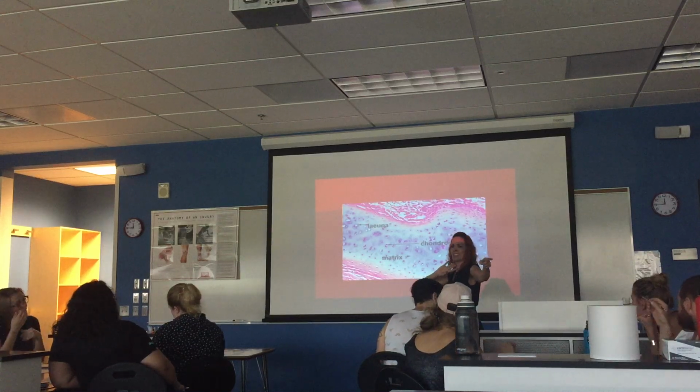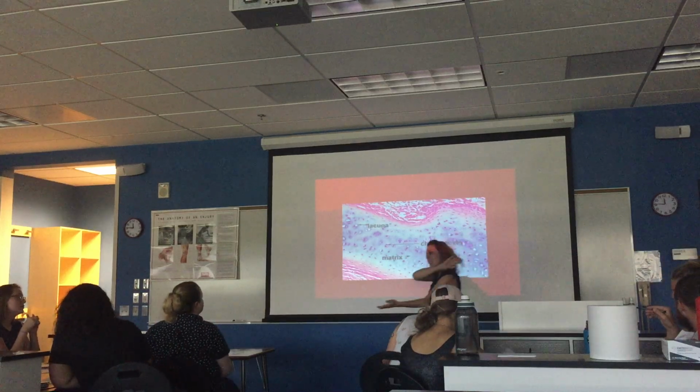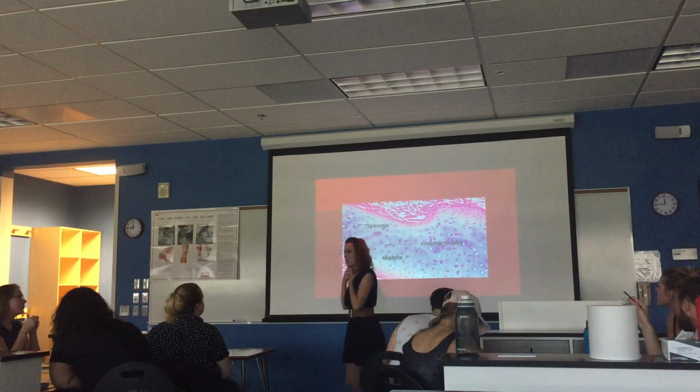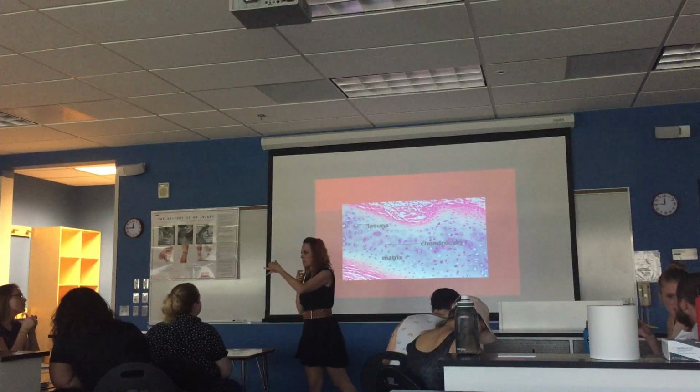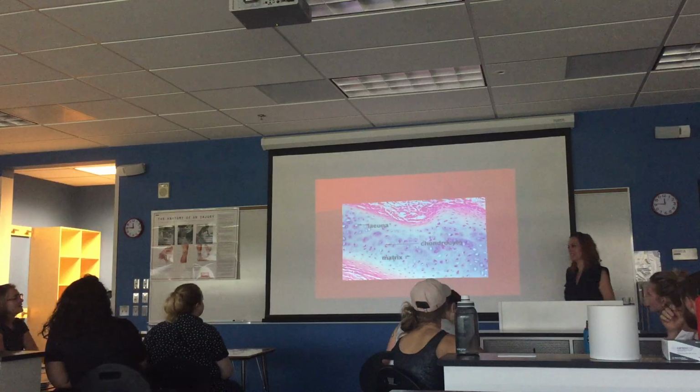Oh, you're like, wait, she said that? The esophagus was the stratified squamous. So if I slice the esophagus, I'm going to see stratified squamous and then smooth muscle, which is helping swallow Jimmy John's. I'm stuck on Jimmy John. I'm hungry.